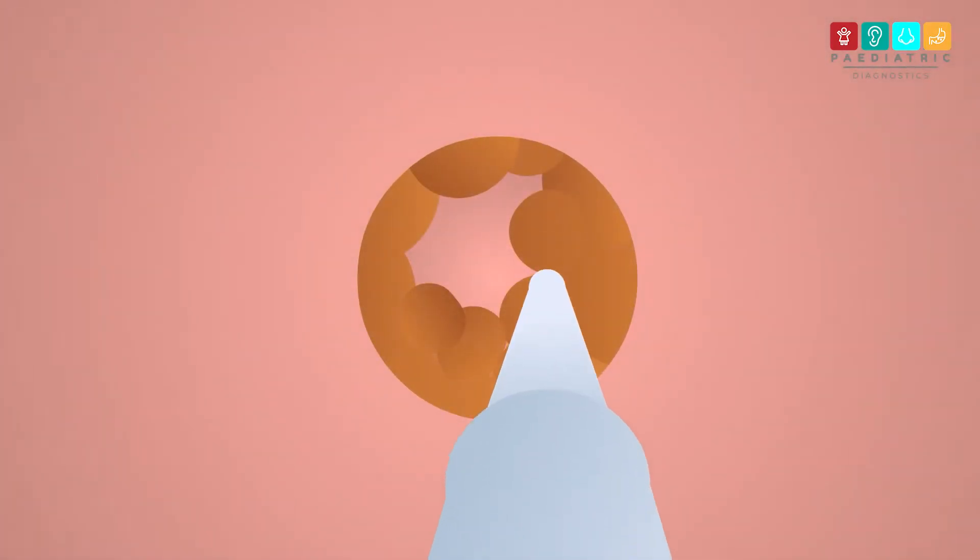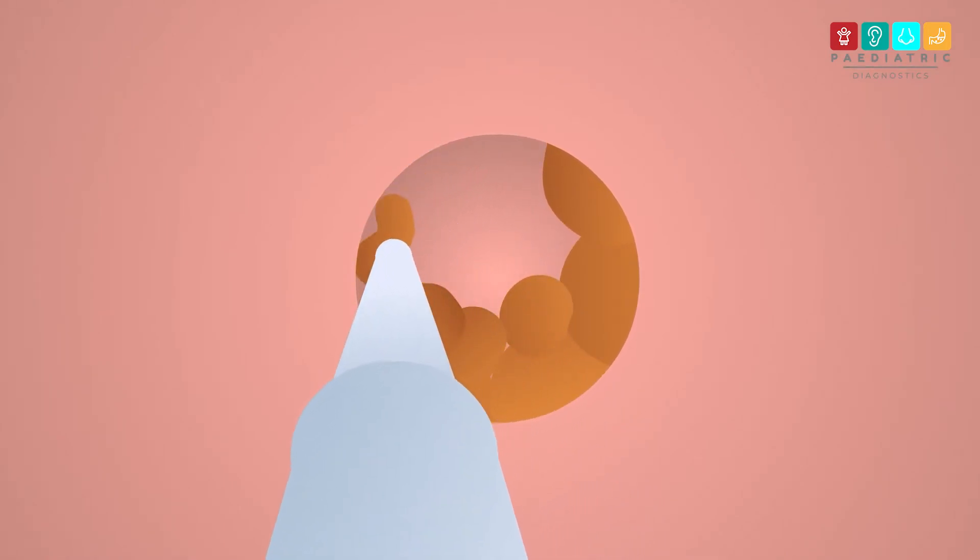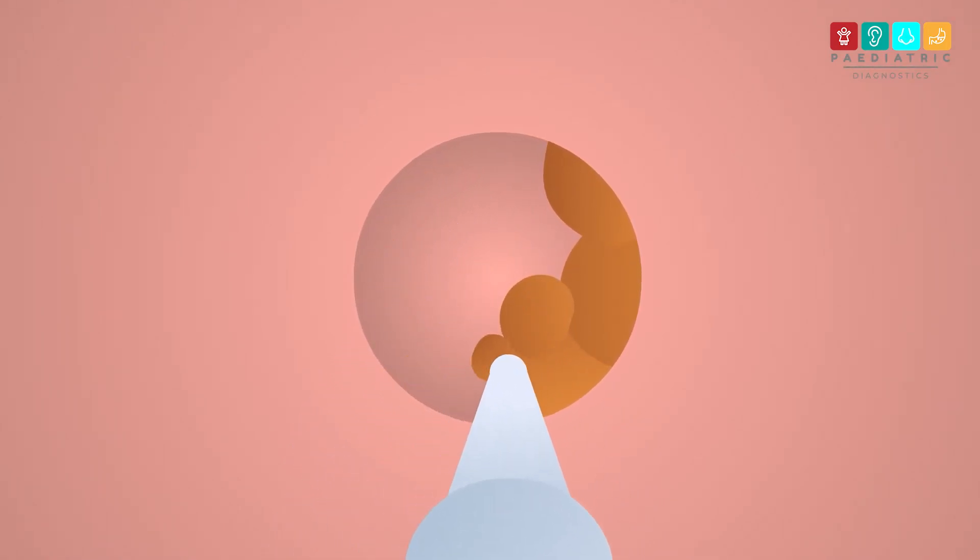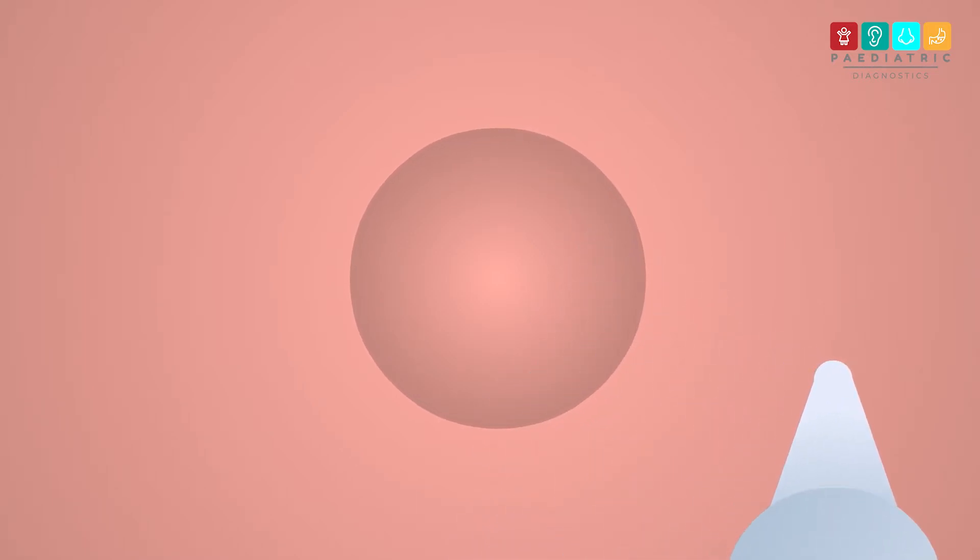It can be slightly noisy in the ear and sometimes it can feel ticklish. In very young children, it can sometimes be more difficult if they can't stay completely still.